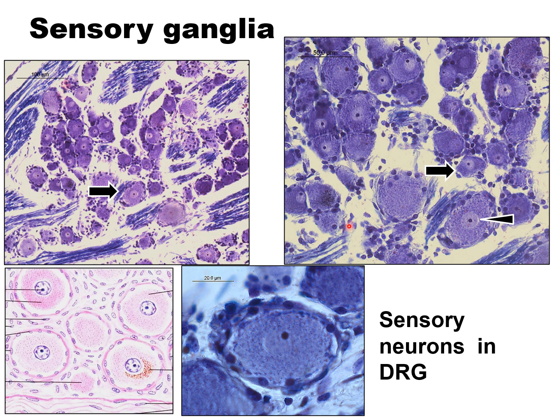So the dorsal root ganglia has bigger neurons with Nissl substance. This is a Nissl stain, so it has coarse Nissl granules. You can identify the Nissl granules in the cytoplasm. Here is the nucleus containing the nucleoli. This is a typical picture of the dorsal root ganglion, which is circular in shape, containing the central nucleus.